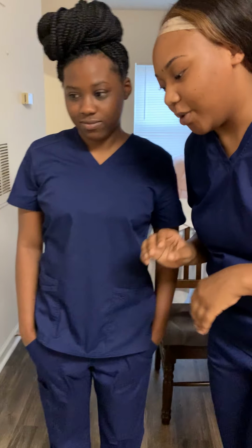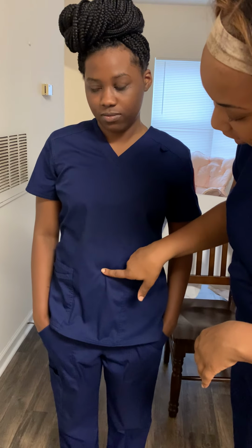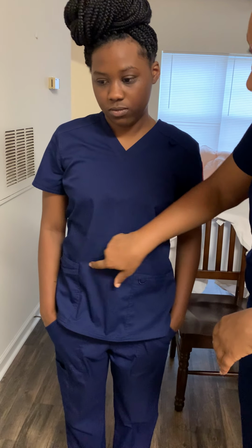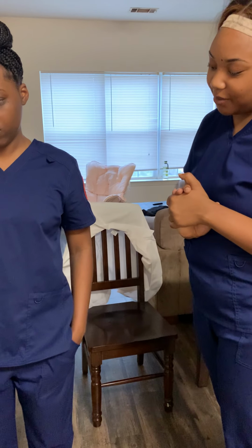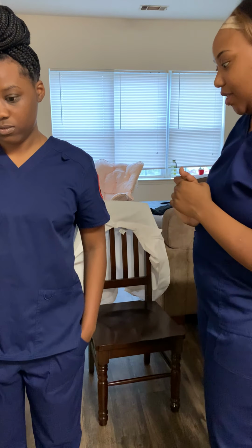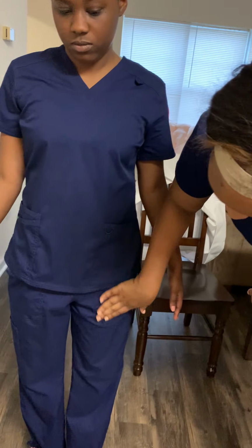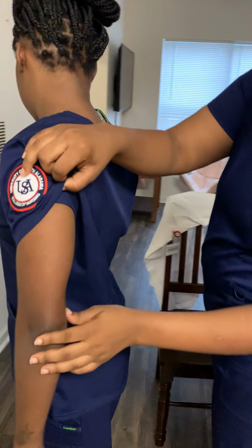On my patient, I would give it at the umbilicus region, so I'll be at the umbilicus, or I will go either 2 inches to the right or 2 inches to the left of the umbilical region, or I could give it on the anterior portion of the thigh, or I could give it on the back of the arm.